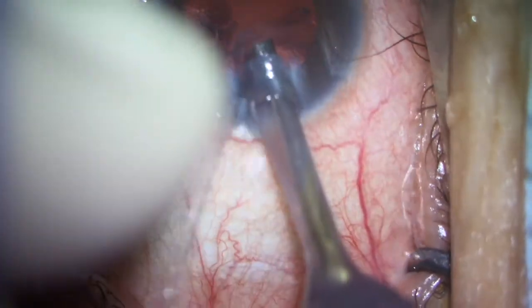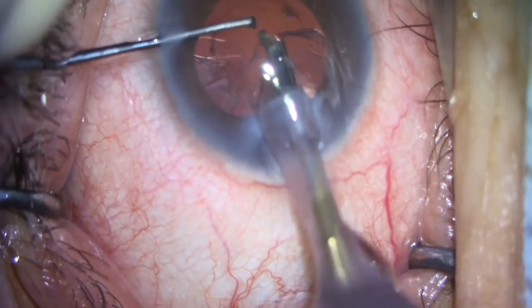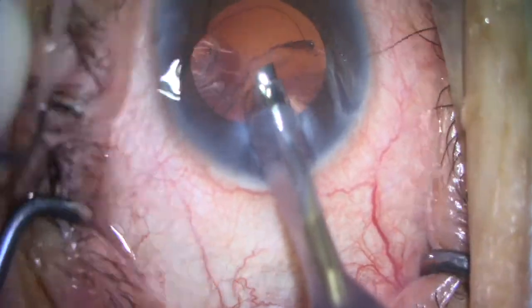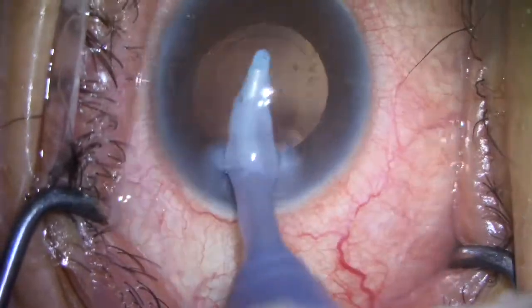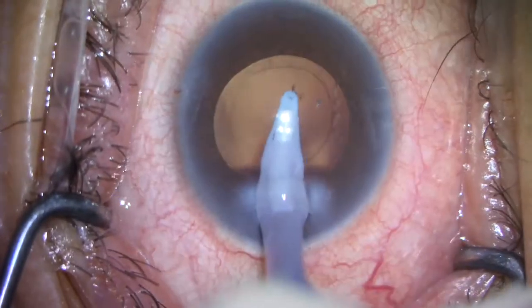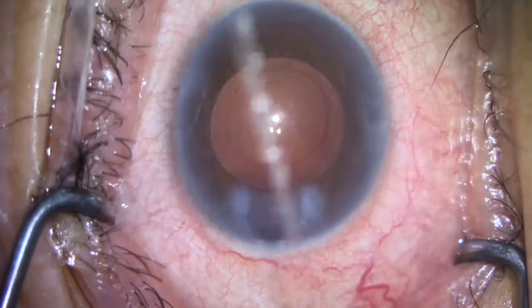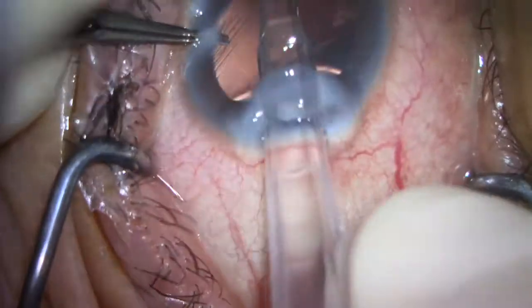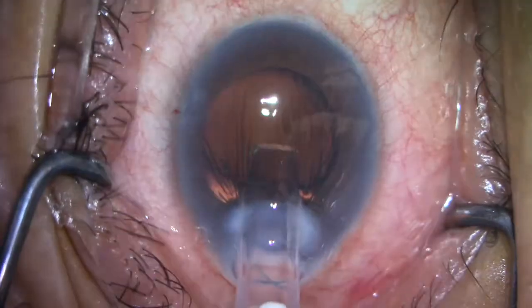I will fast forward here to the final piece of the nucleus, which is coming out here. I then perform some cortical cleanup using my silicone-tipped IA device. You can see the remainder of the cortex and capsule are very clean at this point. A Bausch & Lomb 3-piece silicone lens is placed in the bag and rotated into position.